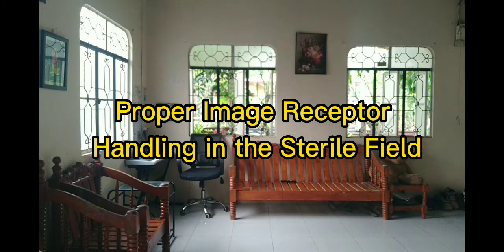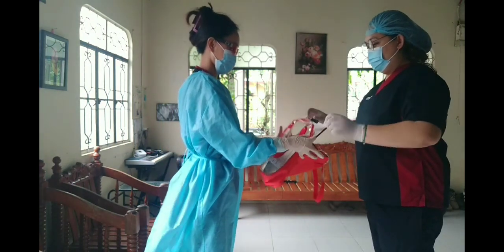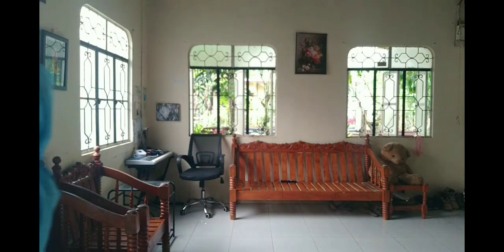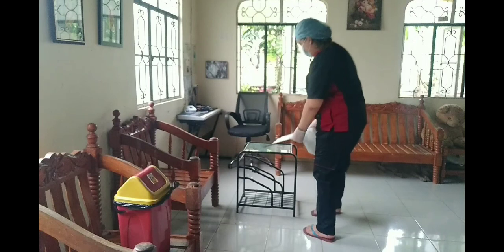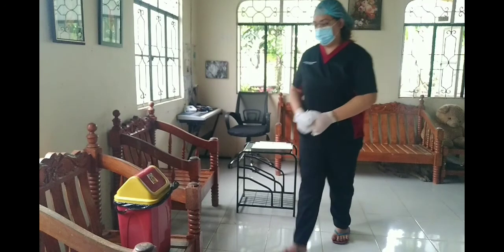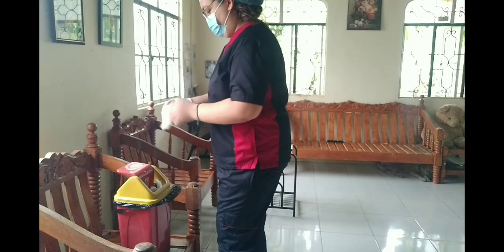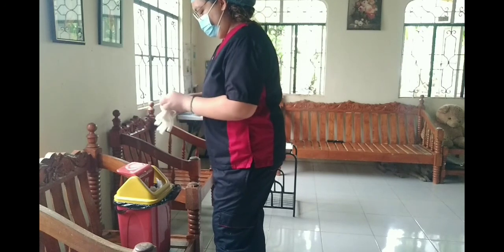The CST holds a sterile IR cover toward the radiographer. The radiographer should hold one end of the IR while placing the other end of the IR into the sterile IR cover. The CST grabs the IR and wraps the protective cover securely. After the exposure is made, the radiographer needs to retrieve the IR. The radiographer must be wearing gloves to accept a covered IR that has been in a sterile field or under an open incision. The radiographer should grasp the IR and open the protective cover carefully away from herself. The radiographer should dispose of the IR cover in a proper receptacle and remember to remove gloves before handling the IR.